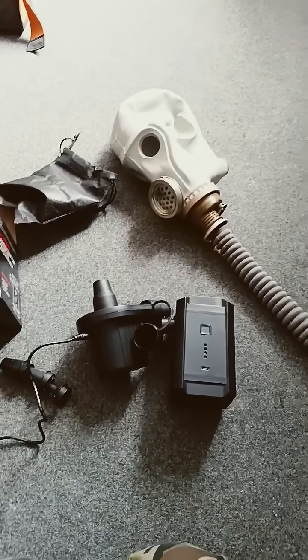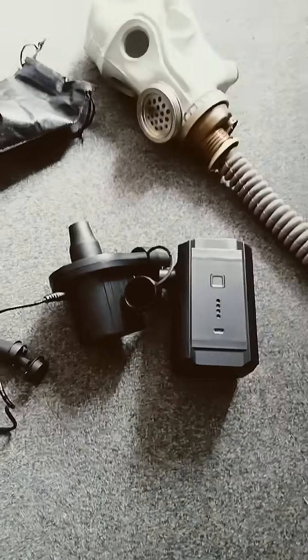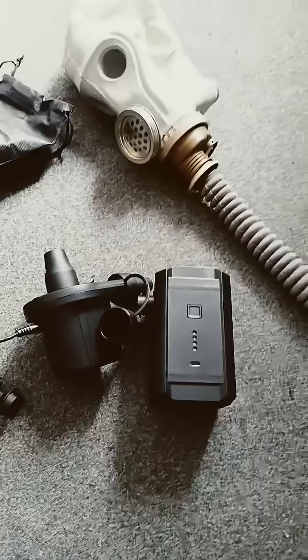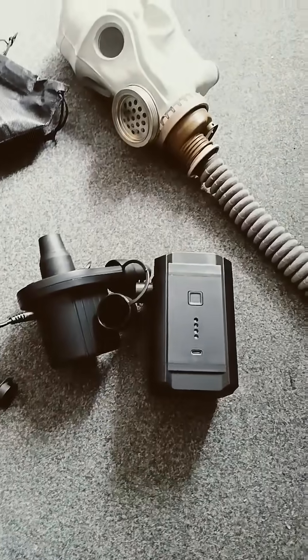Hello. I did a video like this years ago, but I thought it'd be worth doing it again. The idea is basically using a camping mattress inflator as a PAPR system. This isn't ideal compared to the real ones, because it's more likely to burn out and you have to adapt them to take filters. But it isn't as difficult as you'd think.